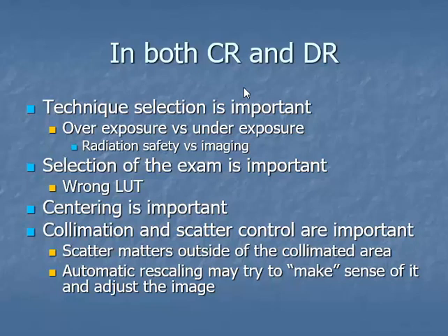There's no way that in the setup of that algorithm they could have possibly imagined that you would do that. So what your resulting image is going to come out looking like is some weird collimation and a totally dark image. It may be totally black and you may not be able to see anything. So it couldn't really make sense of what you were doing. So it kind of freaked it out, and you got an automatic rescaling error.